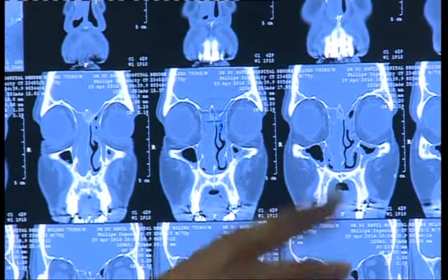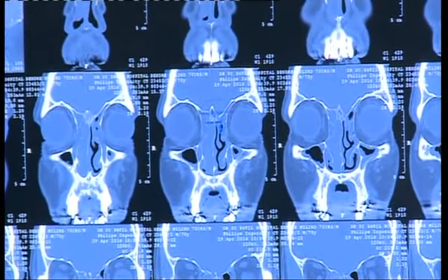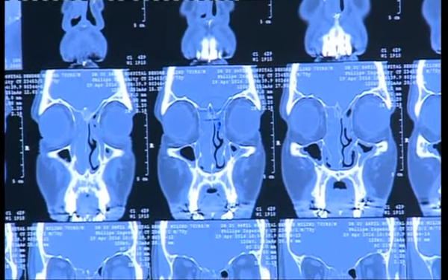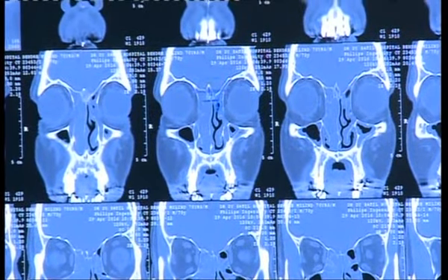So Satish, and I'm going to get Janki also in this, we'll just deviate a little bit. Can you tell me surgically, when you say you have to be careful, what do you do differently when the uncinate is inserted to the skull base versus its natural course of lamina? That's very important. Is there an instrumentation that is different? Is there a surgical stroke that is different? Yes, absolutely. Many a times you can remove the uncinate by the microdebrider, you can remove it by going behind and fracturing it with a curette, or by any other means.